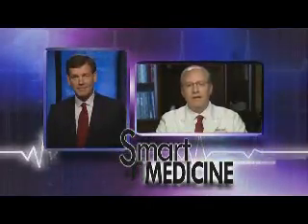I think the technology has evolved, first of all, tremendously just within the past 3 to 4 years. It's almost been a logarithmic expansion in terms of the use of these devices. In terms of the next steps and what's going to happen in the future, I think first and foremost is the idea of these devices becoming MRI compatible. That's been a big limitation and an issue for us in the past. And it's probably one of the most common questions I get whenever I implant one of these devices in my own patient: what are my restrictions? And so the idea of these devices becoming compatible with MRI imaging is going to be something we're going to see in the future.